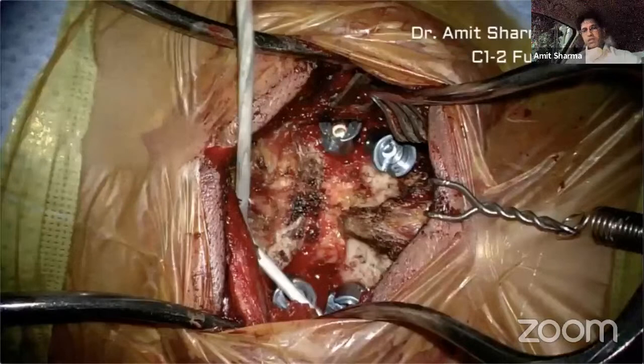Only the tip part is threaded. The proximal part towards the tulip is smooth, and the C2 pedicle screw will always be 4 mm screws. Yeah, I never had any issue with this combination.